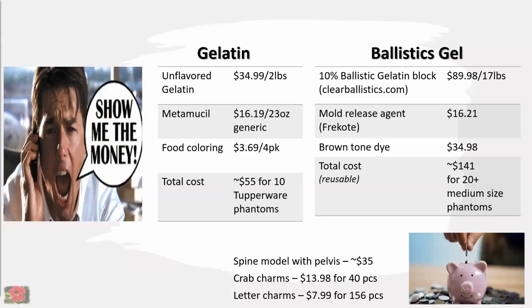Mona, we've got a question in the chat for you here about what is the longevity of these task trainers? Oh, good question. I'm still using my task trainers, vascular access, and umbilical lines that I made 2 years ago. It looks a little deteriorated, like the edges are not as crisp. It's more cloudy because of the gel on top, like old gels. Sometimes they were not completely cleaned after, but I still have the vessels. All I need to do before workshops is just inject more fake blood inside the vessels.